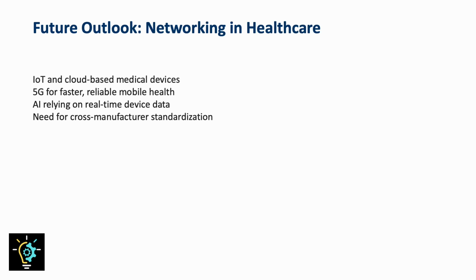The future of networking in healthcare is evolving fast. We'll see more IoT and cloud-connected devices using lightweight protocols like MQTT. 5G will also bring faster, more reliable communication for mobile medical devices. Artificial intelligence will increasingly rely on real-time data streams from multiple devices, making secure and efficient protocols more important than ever.